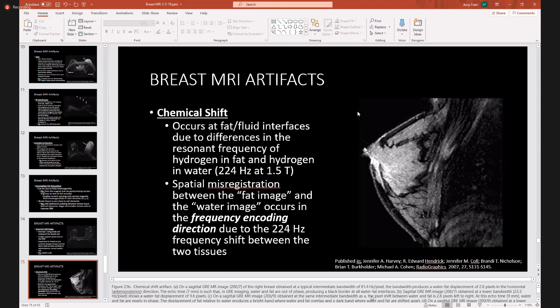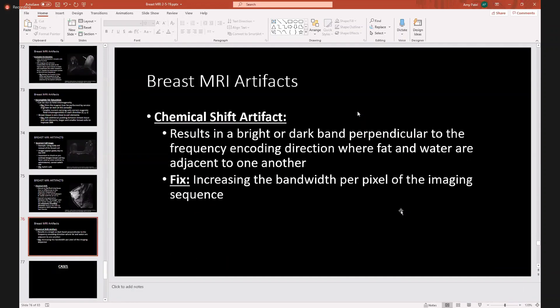Chemical shift artifact occurs at fat-fluid interfaces due to the differences in the resonant frequency of hydrogen in fat versus hydrogen in water. You get a spatial misregistration between the fat image and the water images. Remember, this is the only artifact that occurs in the frequency encoding direction, and it has to do with the 224 Hz frequency shift between the two tissues. To fix chemical shift artifact, you can increase the bandwidth per pixel of the imaging sequence — that is probably the most frequently used approach.